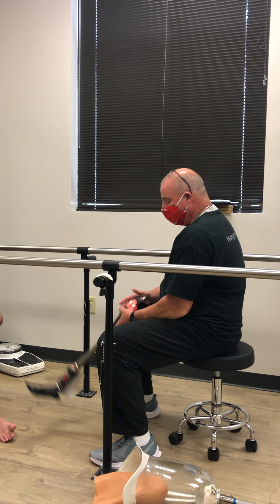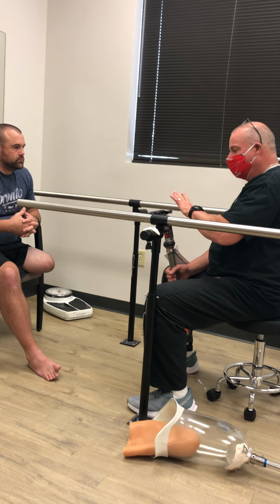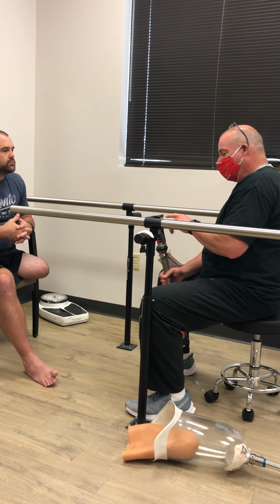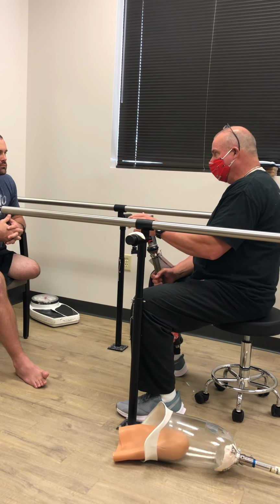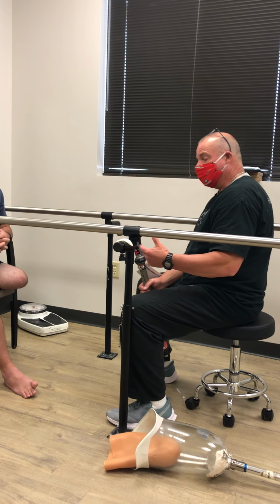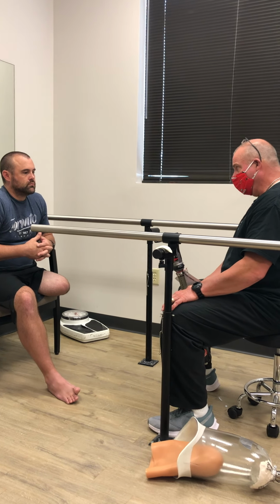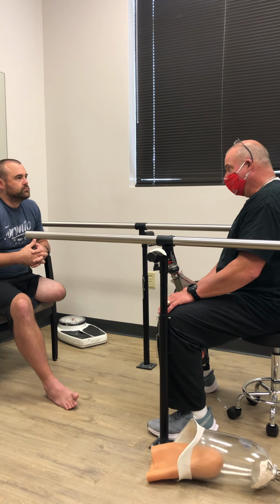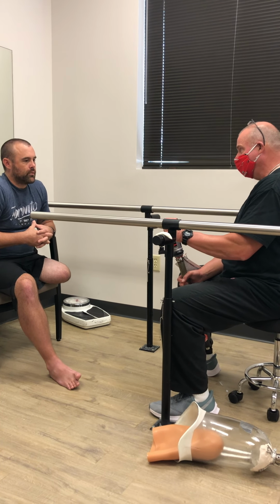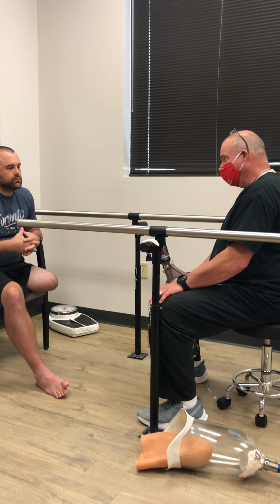Now, the third bad thing is that the foot shells are just cosmetic. It's a foamy type of thing. Eventually, this will cut through the bottom of the foot shell. The bad news is that even though you've got really good insurance and it's workman's comp and all that, and they'll probably get you anything you need, then we're going to play that authorization game. If this is cutting through the bottom of your foot shell, it's going to start tearing your shoes up too. So it becomes a bigger problem.